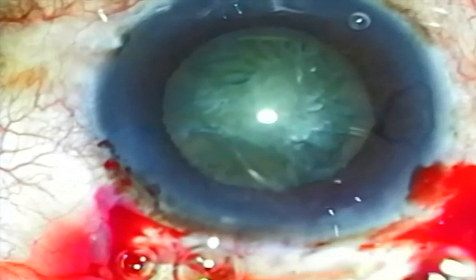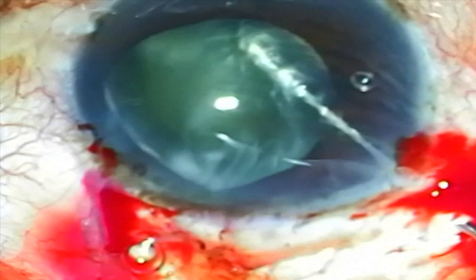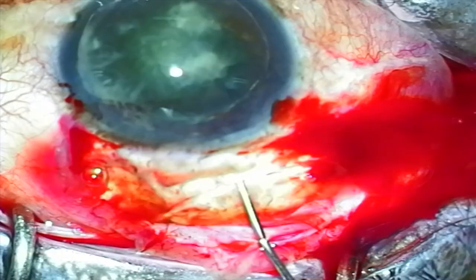This next case is a more brunescent lens. A large capsular rexis has already been performed. I'm using the same technique with the Chang cannula to perform hydrodissection and lens rotation at the same time. In addition, there's some downward force at the edge of the lens, which allows prolapse of the other edge up into the anterior chamber.